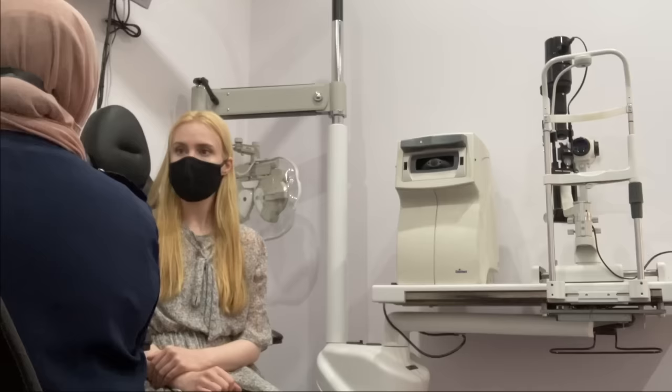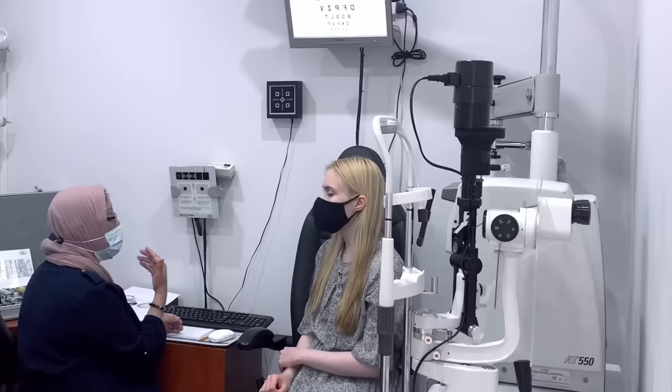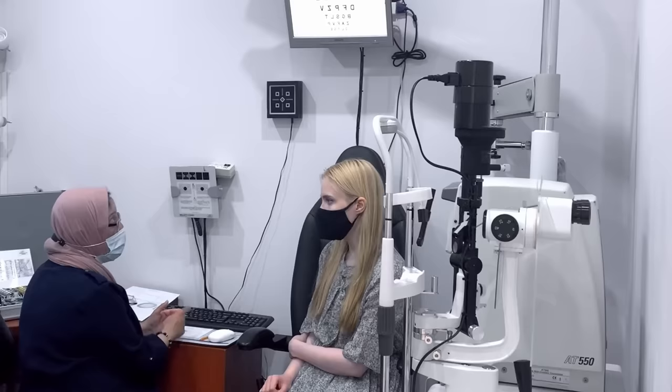And then they also put in what we call a blue control, which we can put in just to help the glare as well. And I think that will help you with your eye strain, as well as the headaches you're getting. Because the headaches you're getting seem to be more related to the actual computer use.